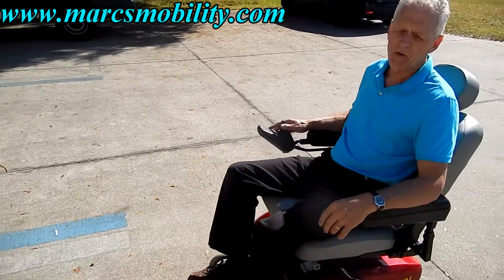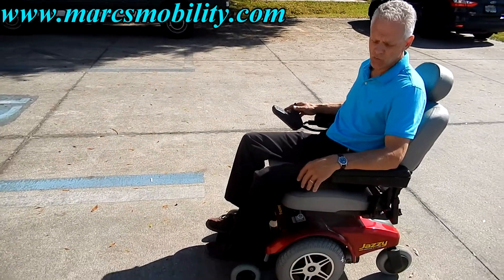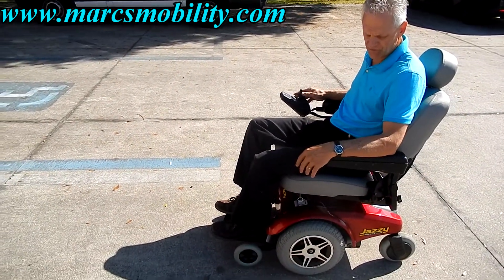This chair goes about 4 miles an hour — not the fastest chair in the world — but it's in new condition and it's a great chair.